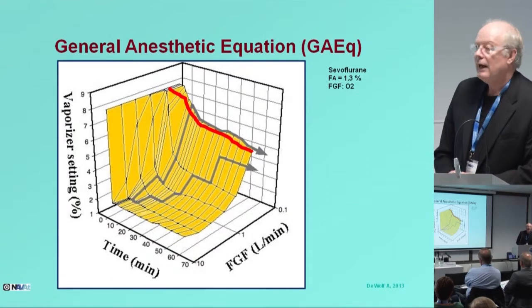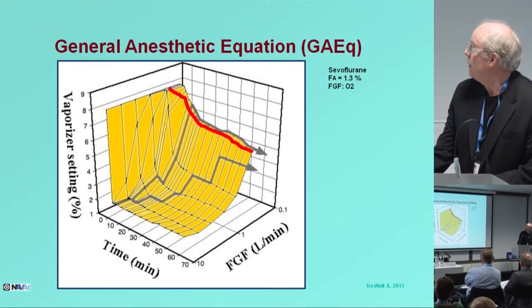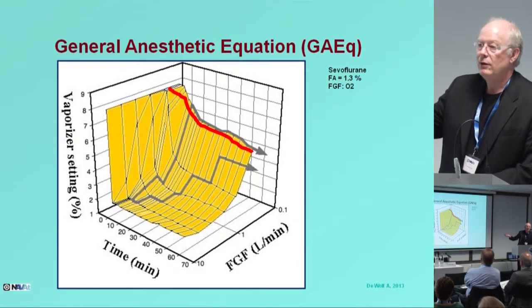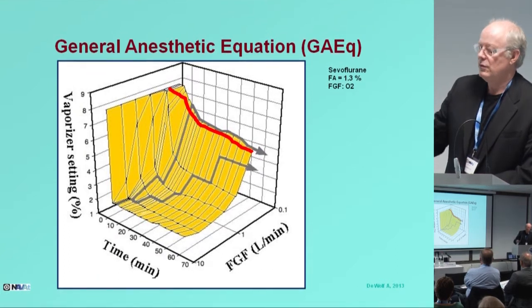But personally, I'm living up there. I start off with very low fresh gas flow from the get-go. I use very high vaporizer settings, and I gradually come down, and I stay in that plane purely by looking at my end-tidal concentration.